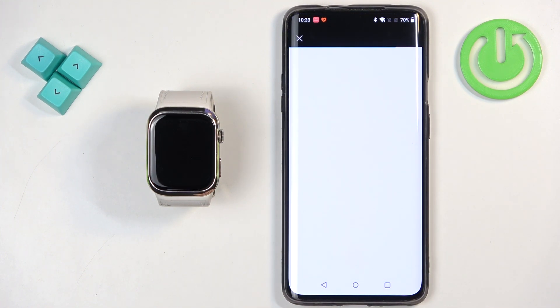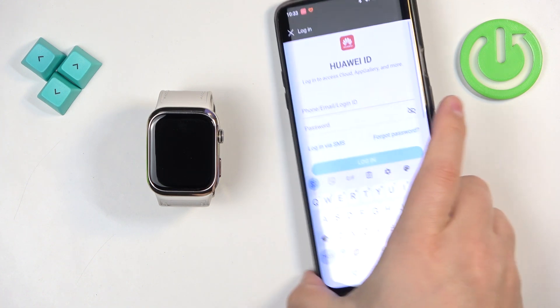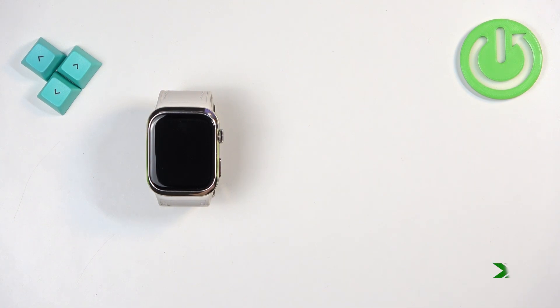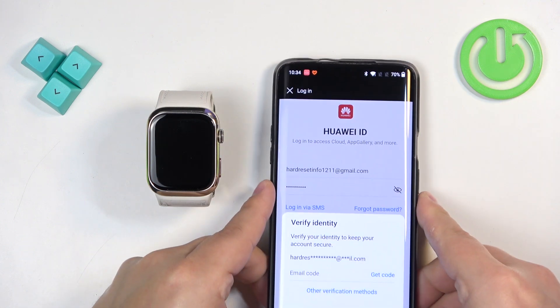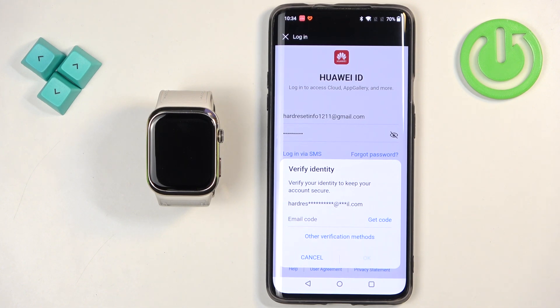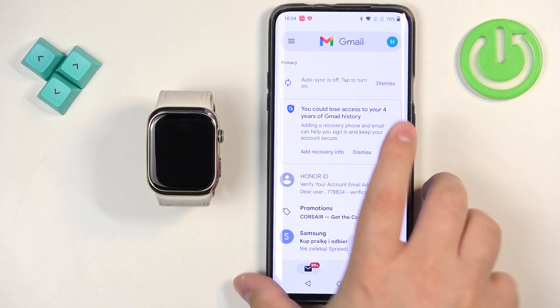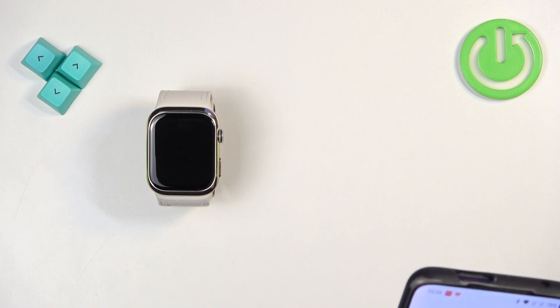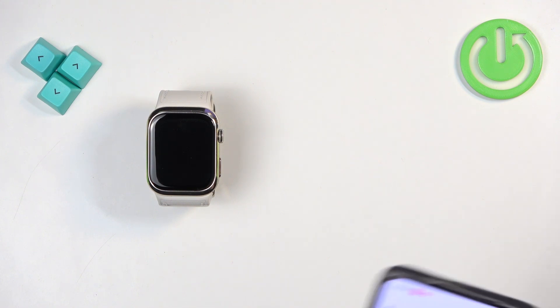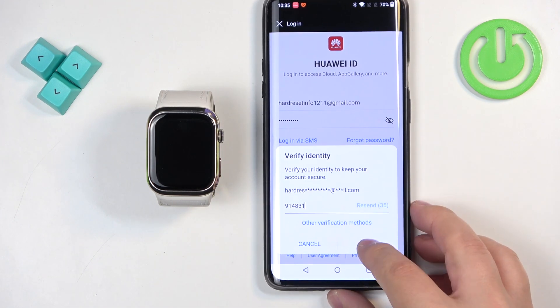The app may ask you to log in to a Huawei ID account. If it does, log in. If you don't have an account, you can tap on register to make a new one. After you log in, you may need to confirm your identity — tap on get code and it will send a code to the email address your account is associated with. Go to your email, copy the code, paste it in, and tap on OK to confirm.